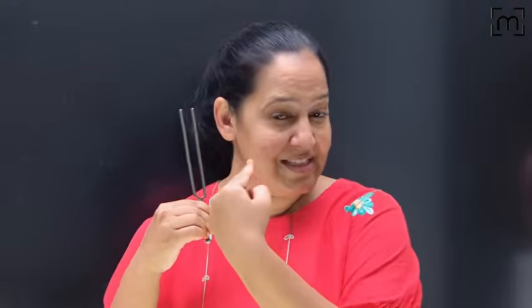Now I'm keeping it here. But I was supposed to hear AC, but I am not hearing. So my BC is greater than AC. It is negative Rinne. You're getting it?